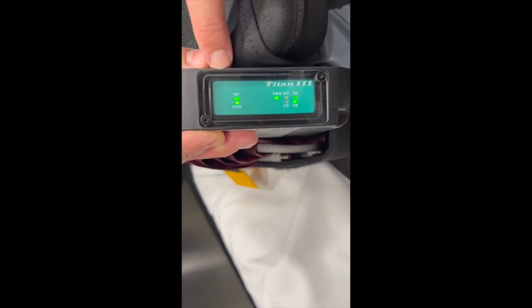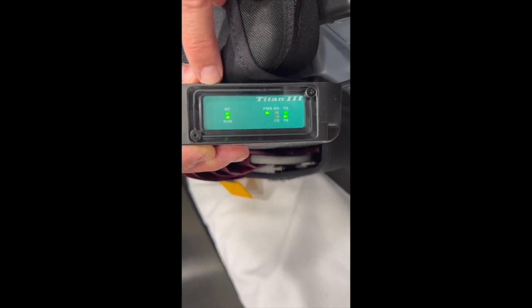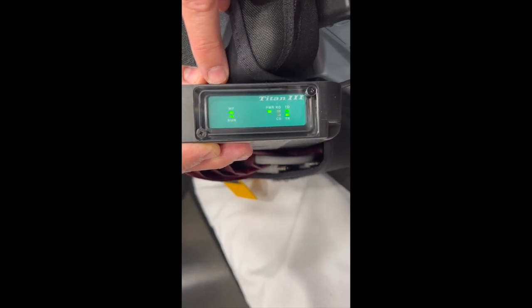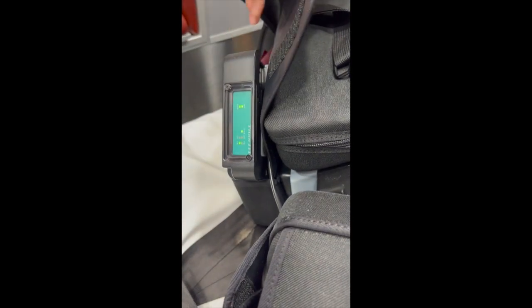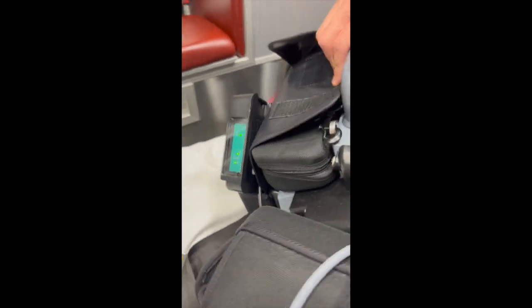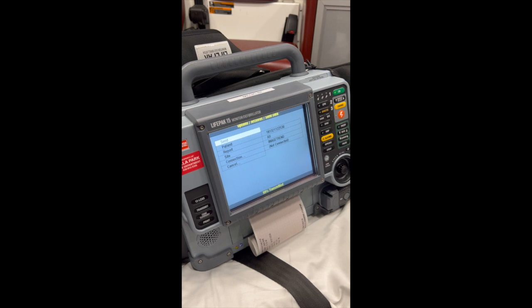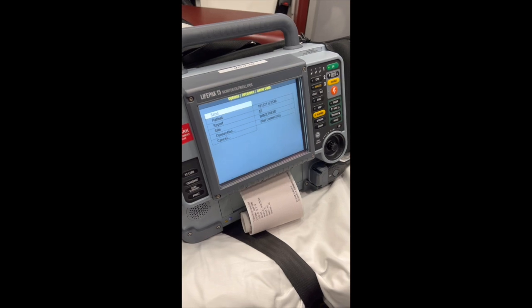These monitors are set up in the ambulances to connect to all 3 ambulances' Wi-Fi and also the station Wi-Fi. So you should have a good signal there, and they work a considerable distance away from the ambulance should you be in a house. The engine monitors are set up to connect to all the ambulances and the station Wi-Fi. So those monitors can be sent once they're back at the station. Come back over to the front here, and the monitor is counting down its transmission. Once its transmission is complete, as you see, it spits out a ticket showing you that everything is complete.